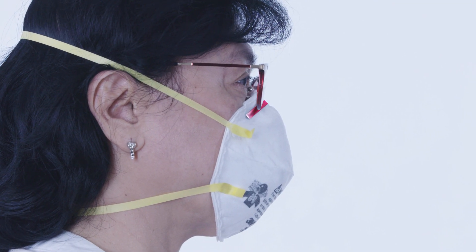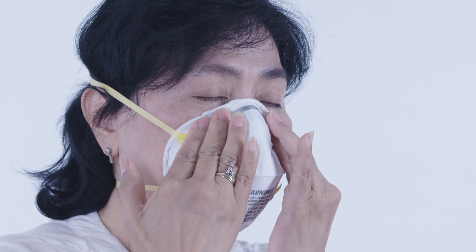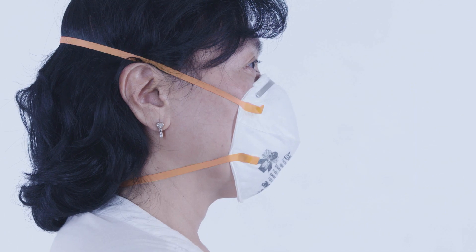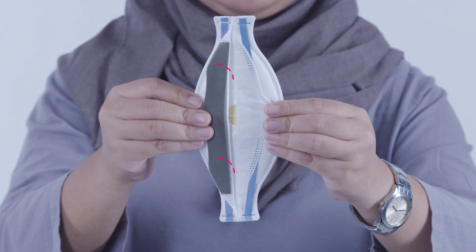Make sure your choice of face mask fits well to your face. Some masks come in different sizes. A good face mask may have a flexible metal nose clip, adjustable or elastic straps, and may also have foam around the edges to help with the seal to your face.